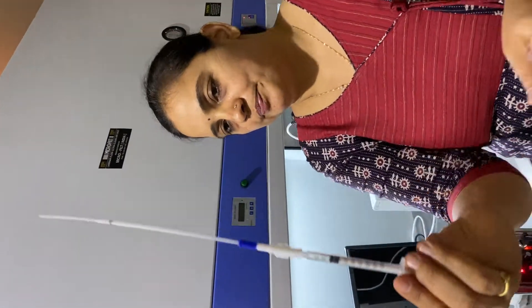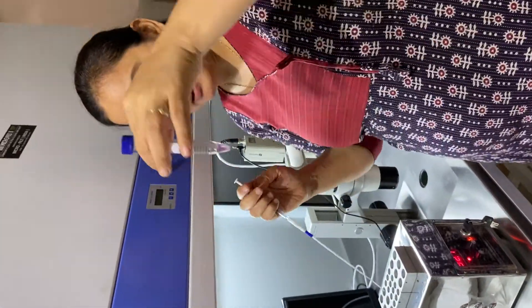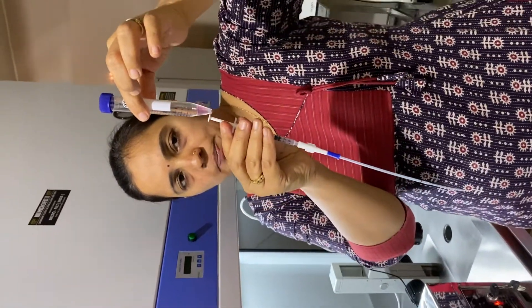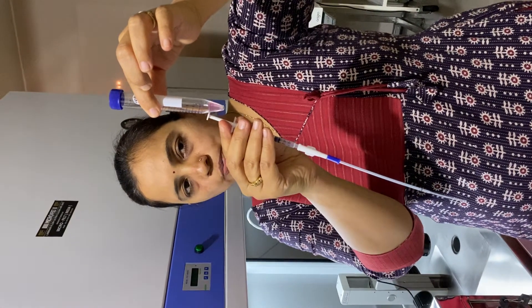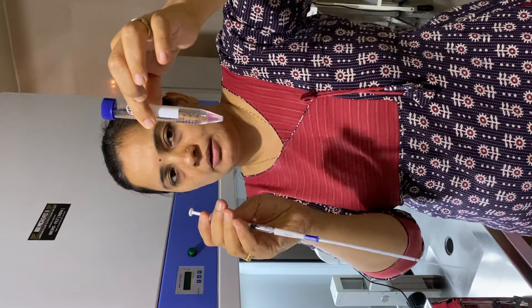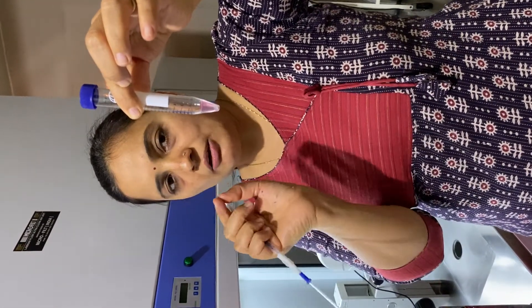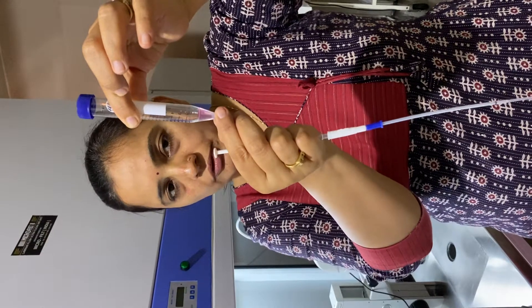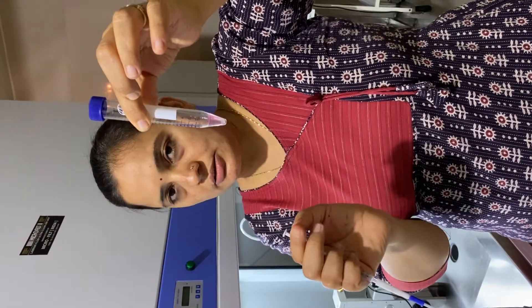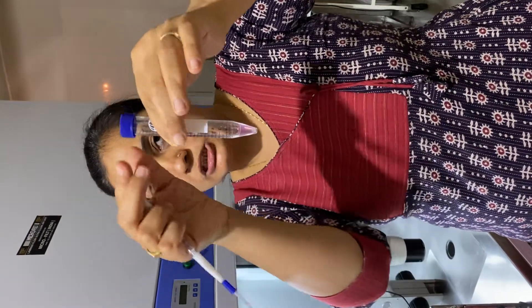Now I am going to load the IUI media. This is the prepared sample — you can see a pellet formation and supernatant fluid. To load the IUI sample, we have to take this supernatant fluid and we have to take care that we should not disturb this pellet. We are going to aspirate only the motile forms.